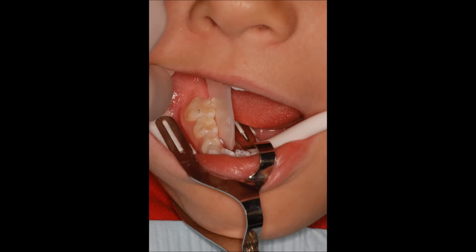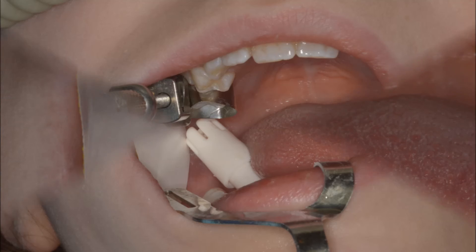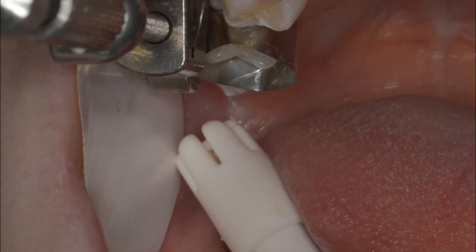Kids do well with the pediatric Garmers. Note the excellent isolation for placing sealants. Pediatric setup for upper restorations — the operative field well isolated. The blocking of the tongue by the saliva ejector contains the tongue into the bottom of the mouth. Close-up view of the same operative site.